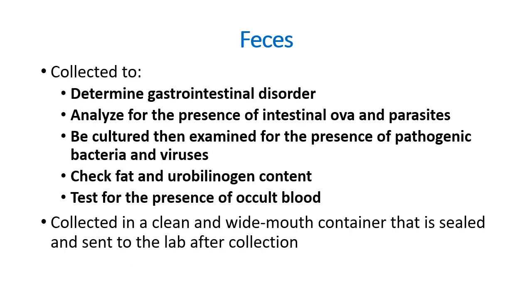So feces naman, or the stool, it is used to determine gastrointestinal disorder, analyze the presence of intestinal ova and parasite. Ito yung pinaka-common kung bakit nagko-collect ng feces. Baka merong parasitic infection. Be cultured, then examined for the presence of pathogenic bacteria and viruses. Check fat and urobilinogen content. At saka used to test for the presence of blood sa feces or stool.